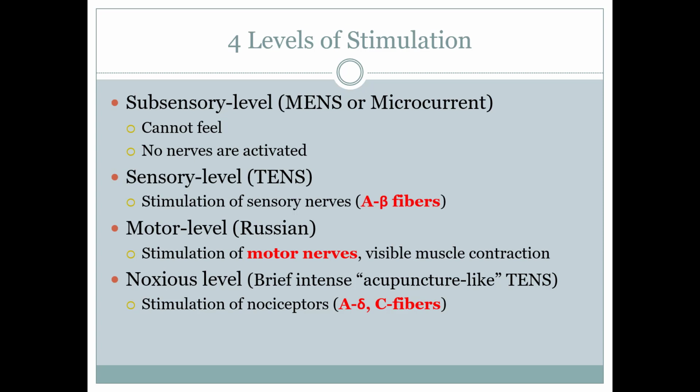Treatment may also occur at a noxious level. However, this is not nearly as common of a treatment due to extreme discomfort. This treatment results in a brief, intense, acupuncture-like transcutaneous electrical nerve stimulation. Noxious level stimulation occurs with activation of the nociceptors, the A delta and C fibers.